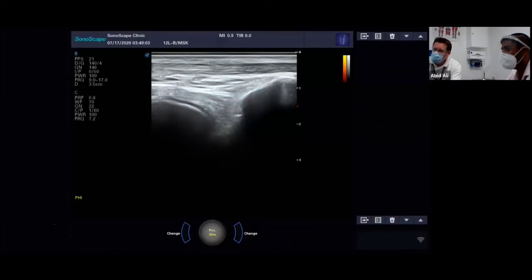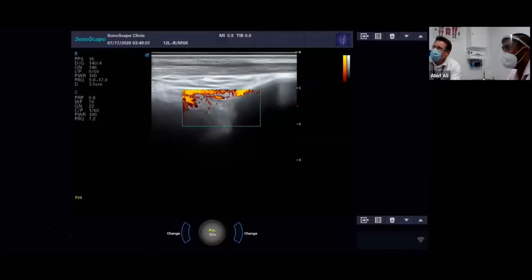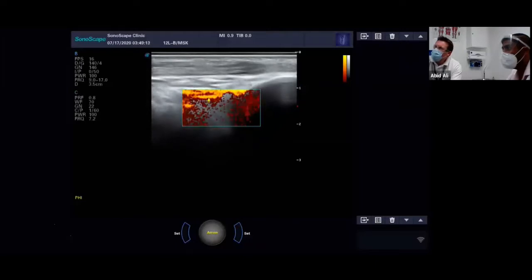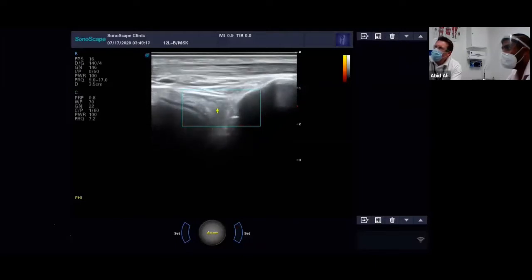And you can look at this with colour flow, so you'd see movement, lots of flashing lights in here. We don't want flashing lights. So if we look at a normal ankle, it should be absolutely clear. You shouldn't be able to make out any coloration at all. If you put this square box on and you see this sort of stuff, that's a problem.